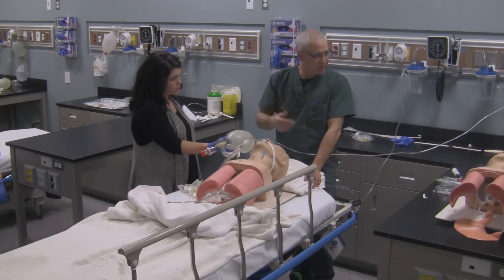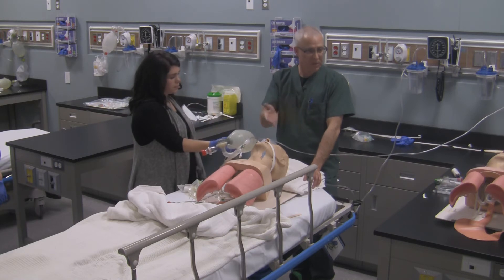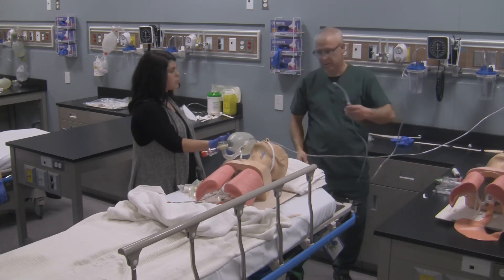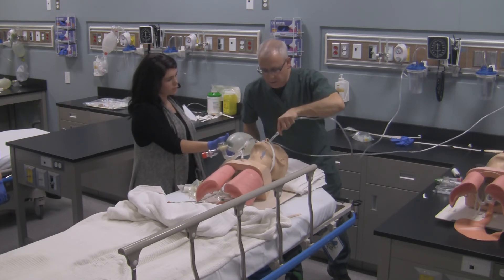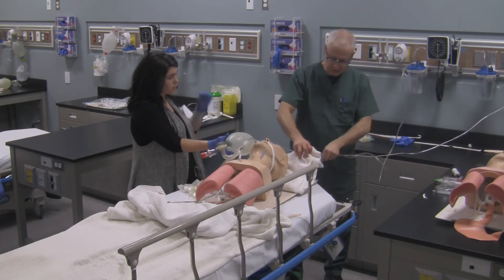Or you can suction out the pharynx if needed, or start getting ready to set the patient up on a ventilator with mechanical life support — because you're not going to stand here and bag until the X-ray is done. If the patient needed pharyngeal suctioning, I could go and suction them out, placing that Yankauer to the back of the oral pharynx, or potentially putting a suction catheter down as well.